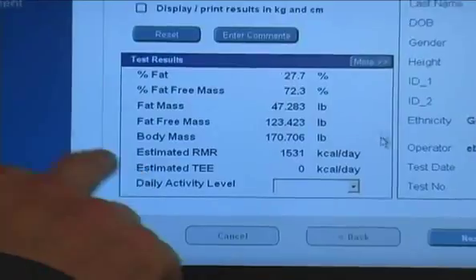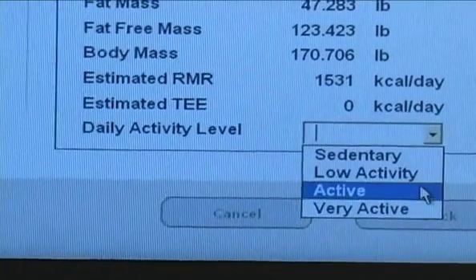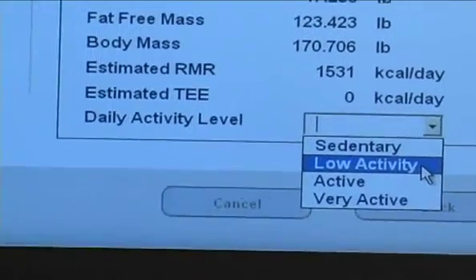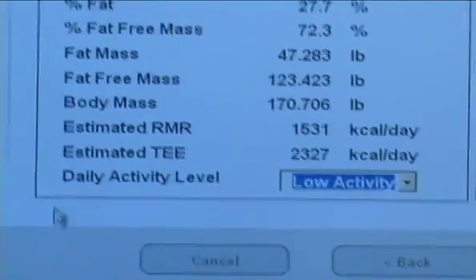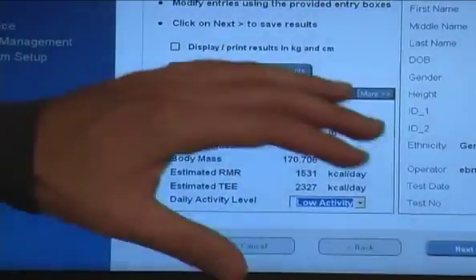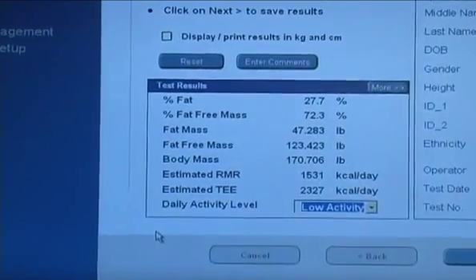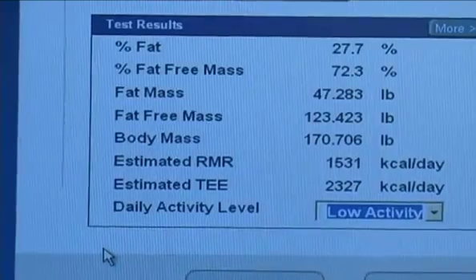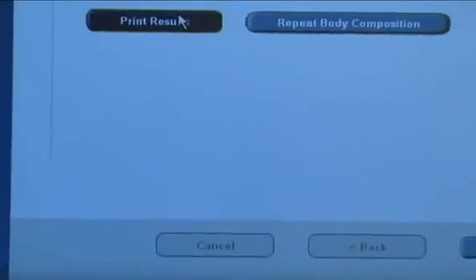What's your activity though? Are you very active? I'm not right now. I'd like to have done nothing for a month. Okay, so low activity. We'll select low activity. And that's for the total energy expenditure. So it gives you body composition information as well as metabolic information. So resting metabolic rate and total energy expenditure. So you can click next and we'll print the results.